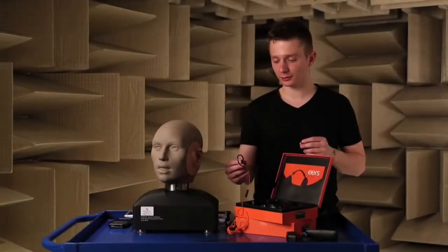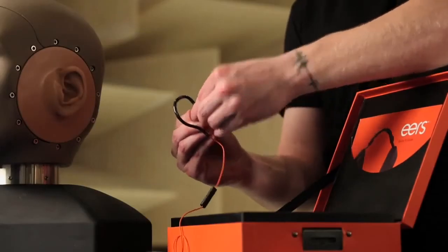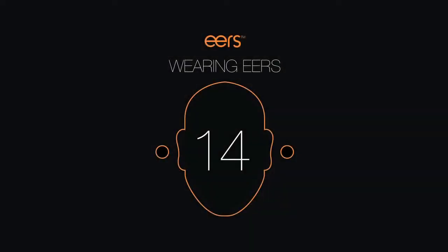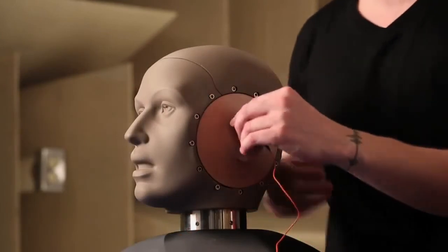Now take the caps with the ears logo and snap them onto the back of the earphone. To properly put on your earphones, start by placing the earhook behind your ear and then insert the tip.